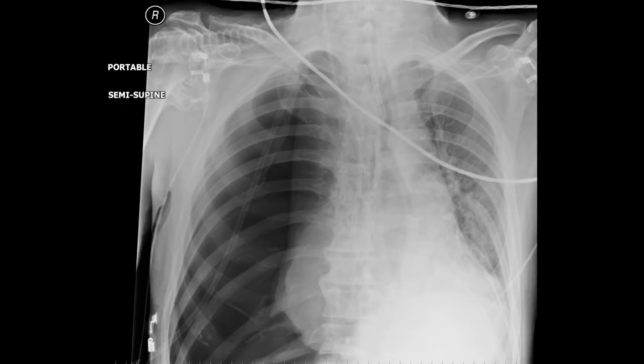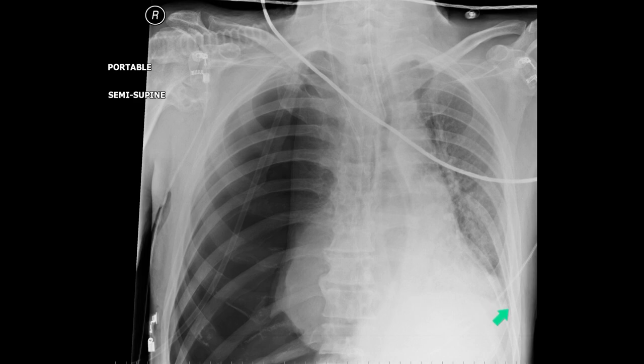Here is a case. The patient had a right internal jugular line put in, and as soon as the line went in, the patient became unwell, breathless, and started to exhibit signs of circulatory failure. You can see that the left hemidiaphragm is much higher than the right hemidiaphragm, which is so low it can't even be seen on the film.